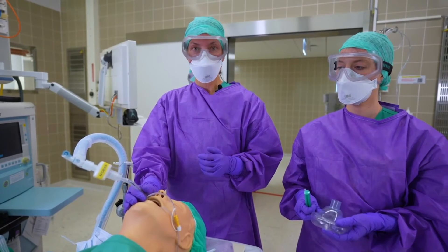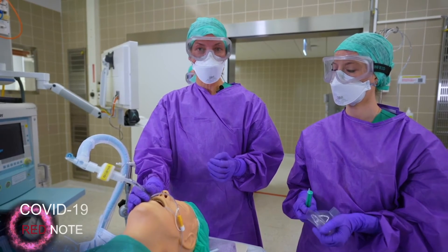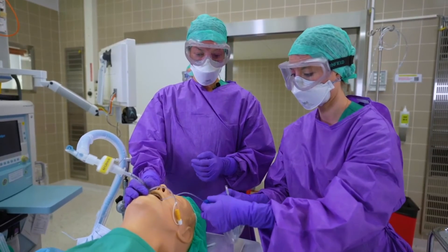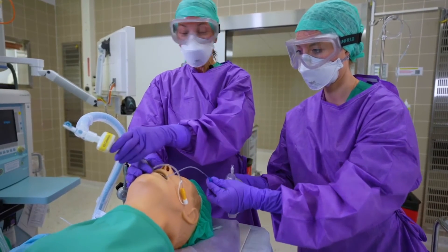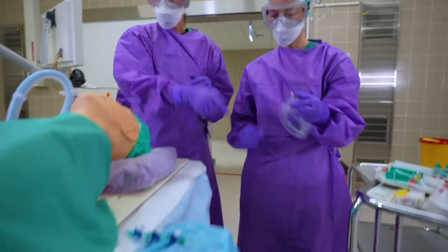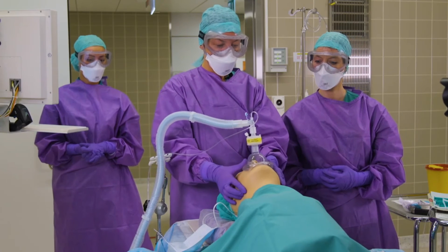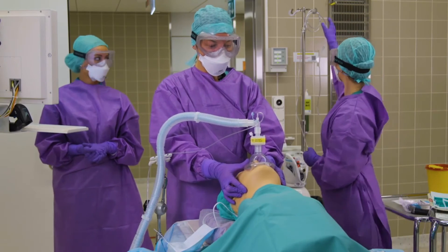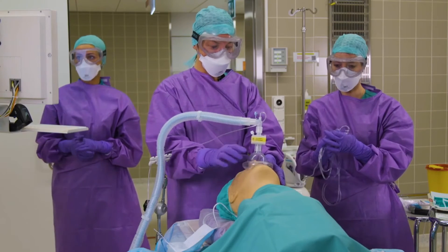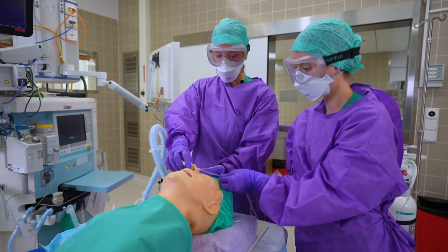It is important to avoid coughing when you extubate the patient. IV lidocaine or remifentanil come in handy. When you extubate, you are not utilizing positive pressure, but rather you are deflating the cuff and pulling the tube. We dispose of the tube right away and oxygenate the patient with a tight-fitting mask. Once the patient is adequately breathing, we are utilizing nasal prongs for transport. After the nasal prongs are on the patient, the patient will also receive a surgical face mask.